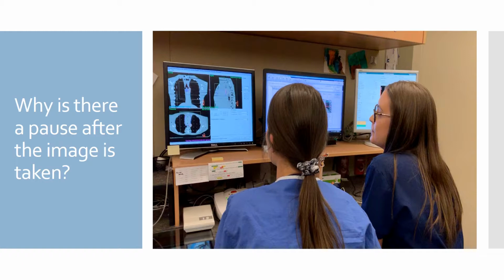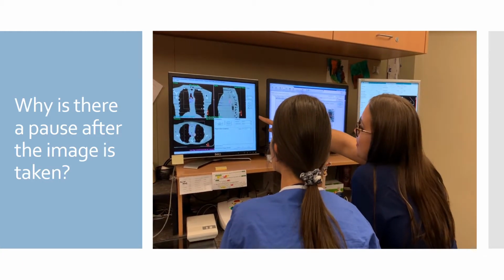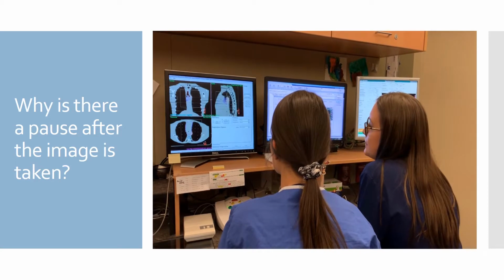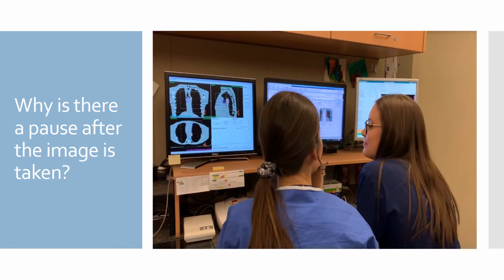After the image is taken, there will be a slight pause. This is when the radiation therapists are looking over the image and matching it to your treatment plan. Some days the matching process takes longer than others, so don't worry if one day seems like it's taking longer than usual. It could just mean the doctor is coming to verify the match is perfect.